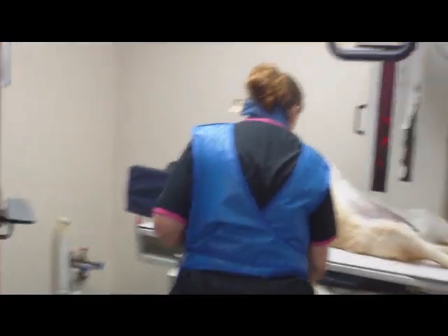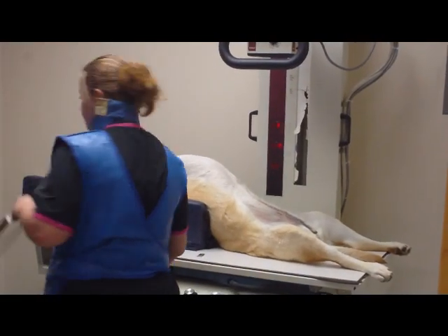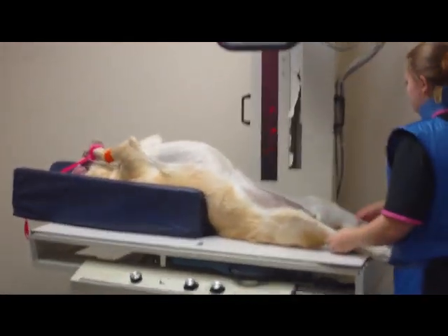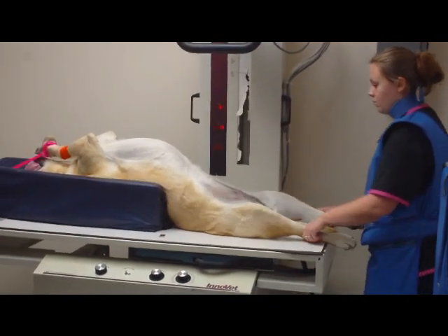My lead gloves will be donned later. Since this animal has been sedated, I am using a foam wedge to support its body. I have her hips hanging off of the edge of the wedge, with her forelimbs pulled cranially.